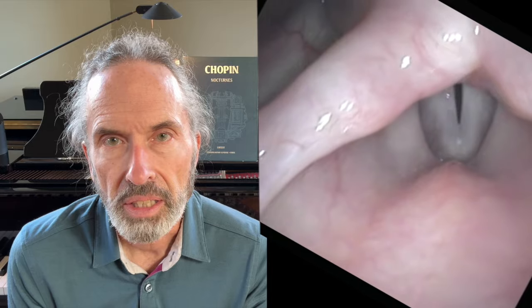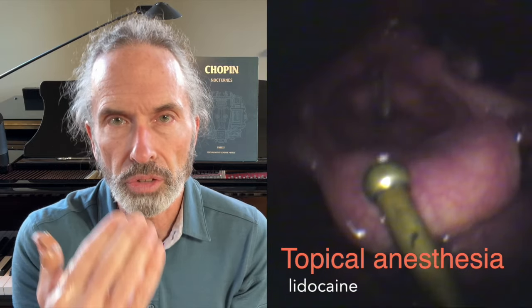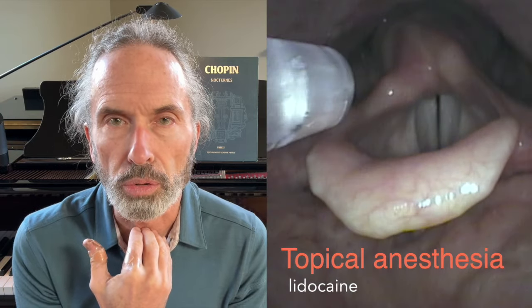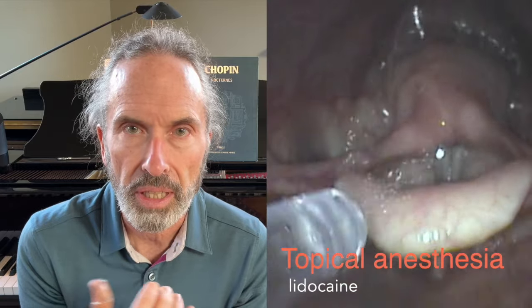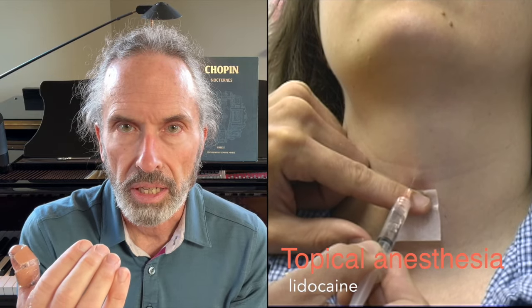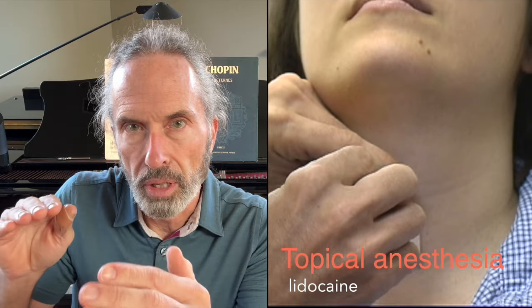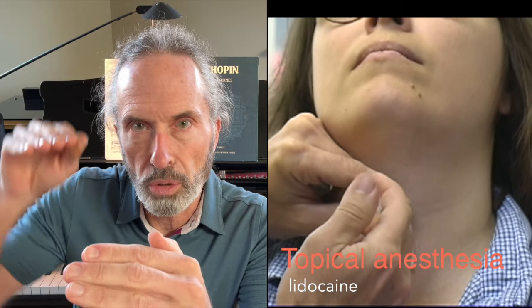The key to this is to use topical anesthesia on the vocal cords, anesthetize them with lidocaine, and put our camera in. And when we get the endoscope in, we want to go in under the arytenoids, lift them up, and then we can see the vocal processes. Let's take a look at some examples.